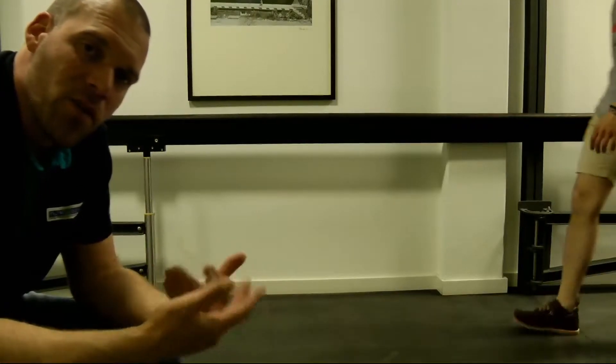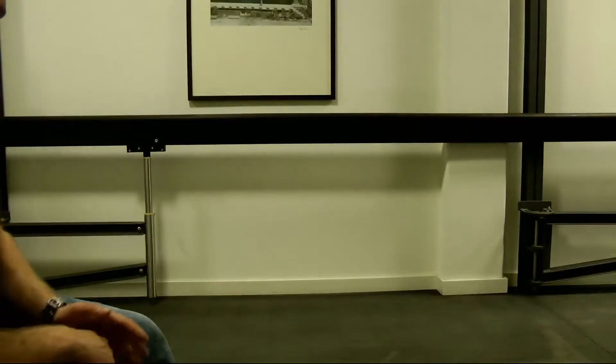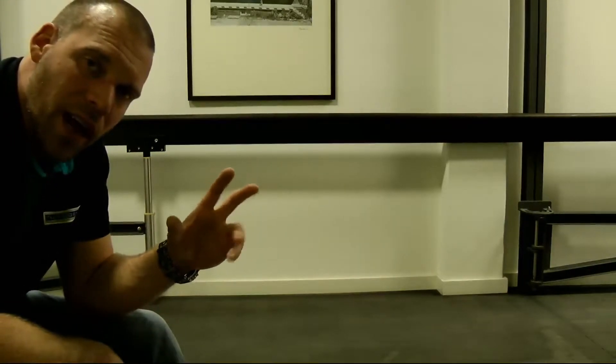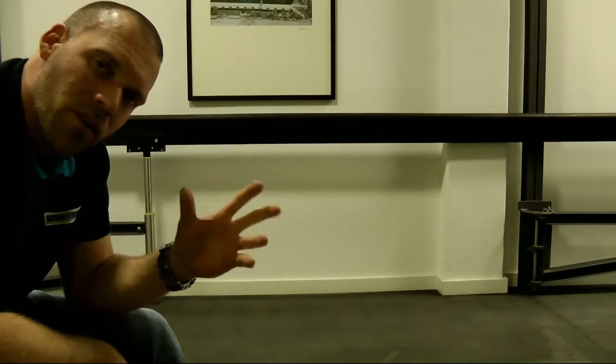This is the great advantage of the neuroswing ankle joint — all the settings can be adjusted separately and are independent of each other. An example would be that we can provide more or less spring strength without having to change the static alignment.